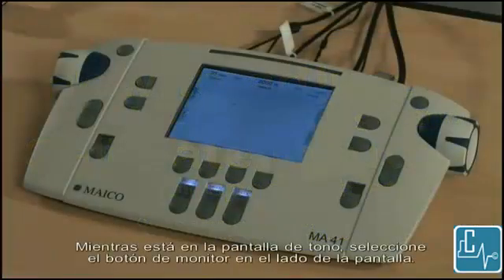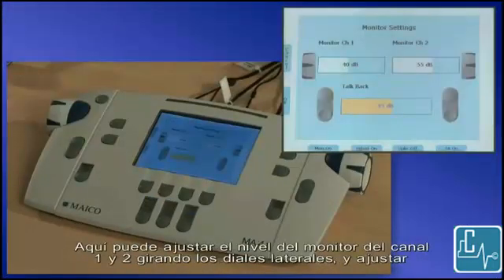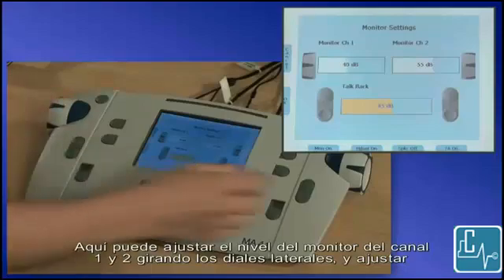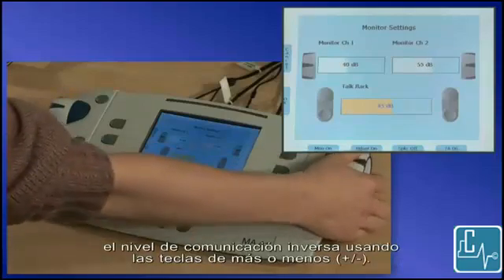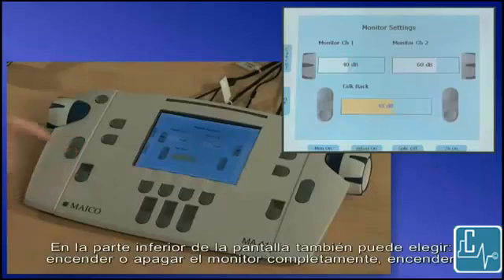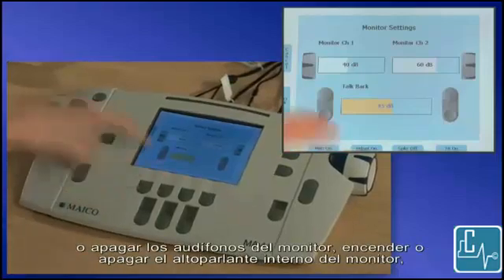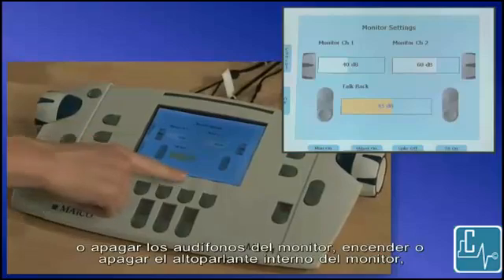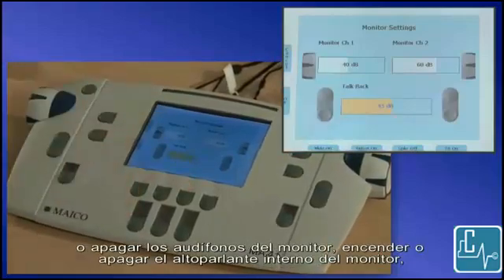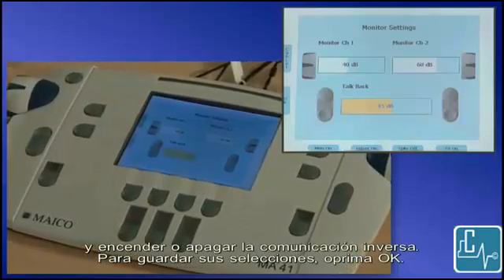While in the tone screen, select the monitor button on the side of the screen. Here you can adjust the level of the monitor of channel 1 and 2 by turning the side dials, and adjust the level of the talkback using the plus or minus keys. At the bottom of the screen you can also choose to turn the monitor completely on or off, the monitor headset on or off, the internal monitor speaker on or off, and talkback on or off. To save your selections, press OK.